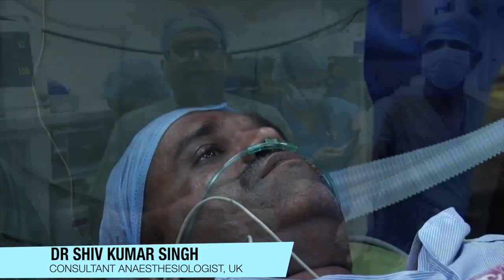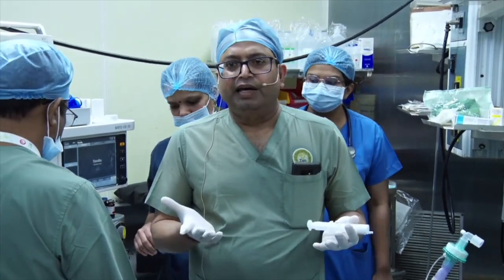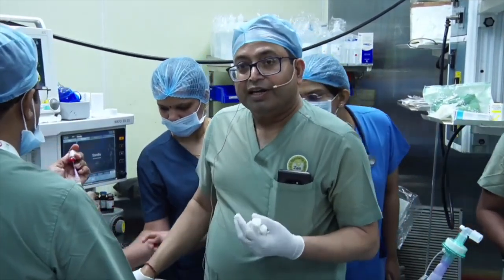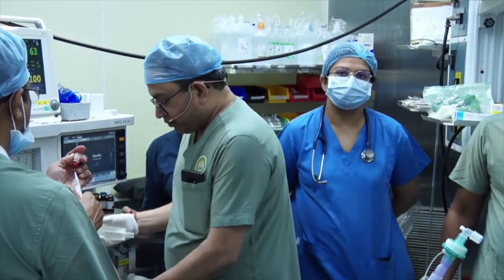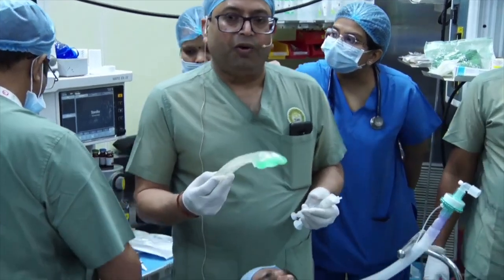We are going to demonstrate insertion of the i-gel, a supraglottic device. Some people find it difficult, but I'll tell you the tricks for that. One thing is the way you hold the i-gel.